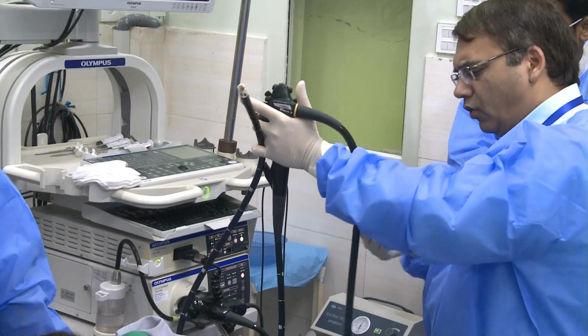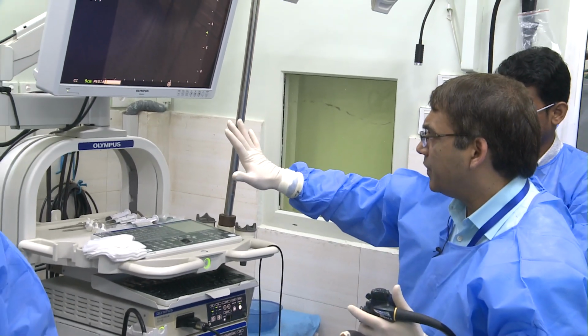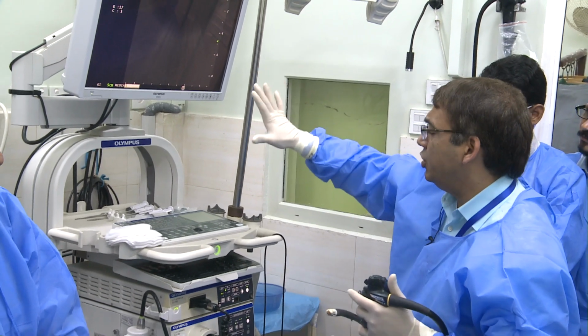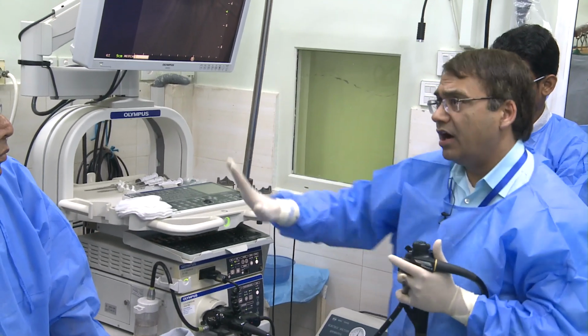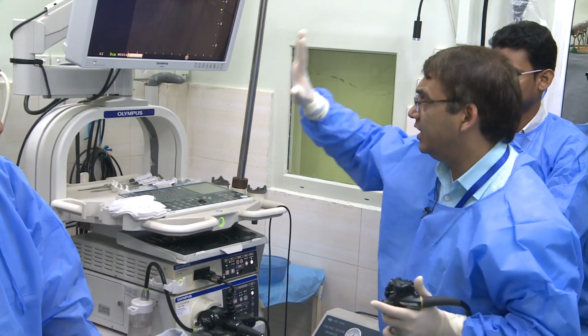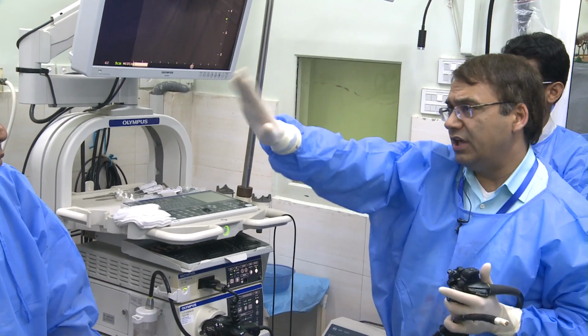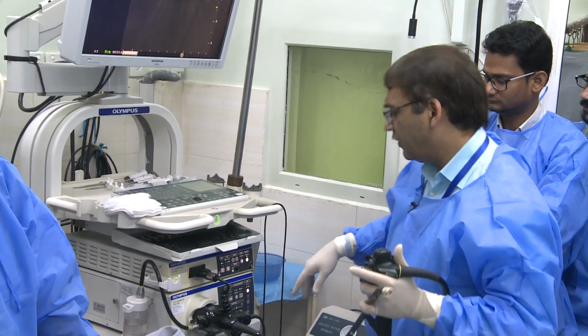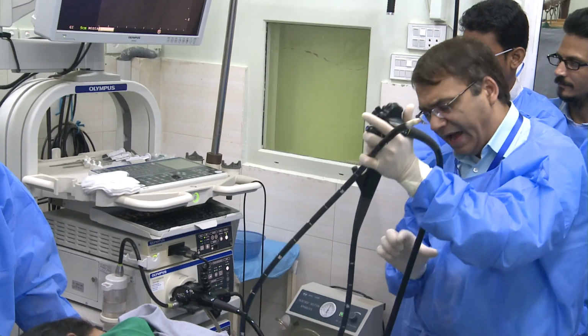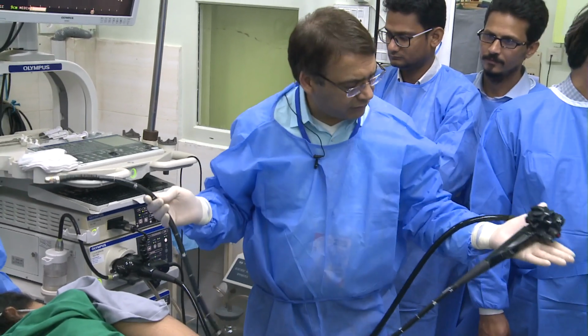back. So I move the cord around me and it's on the back, even though the screen, EUS screen, one is here, but my EUS and endoscopic screens are right in front of me. Here the EUS screen is here, which is fine. Endoscopic is over there, which is fine too. So far, because it's not on my back, I'm going to keep the cord right in front of me. This is how I hold the scope.